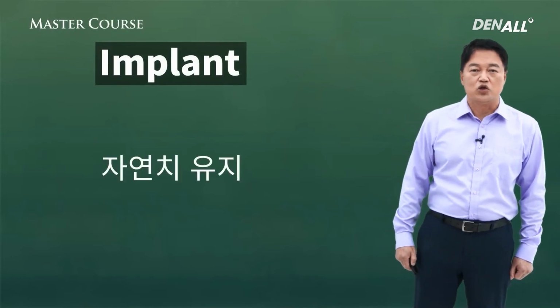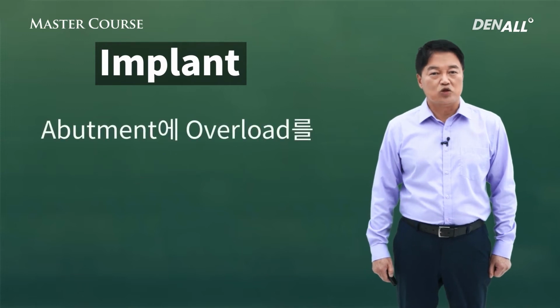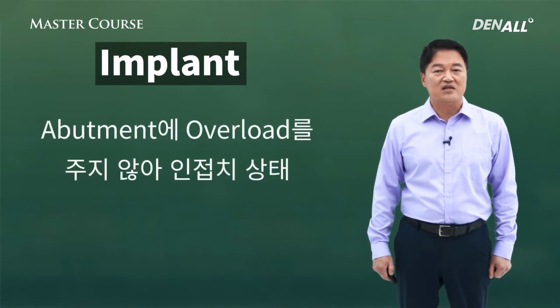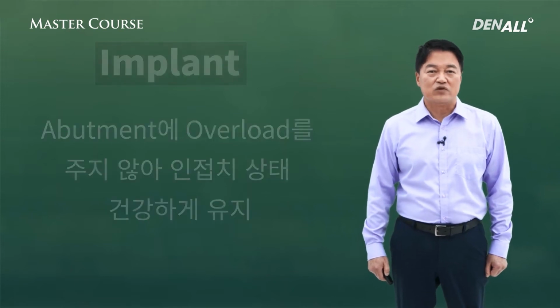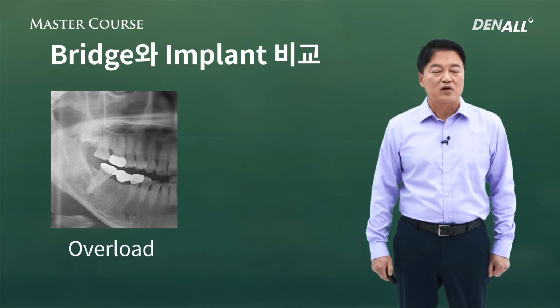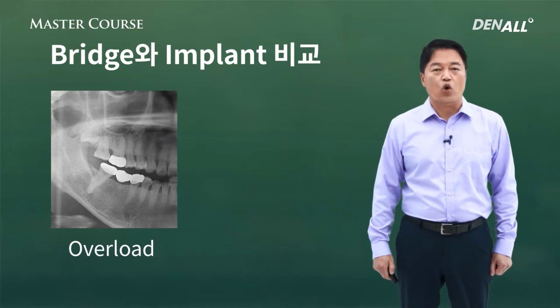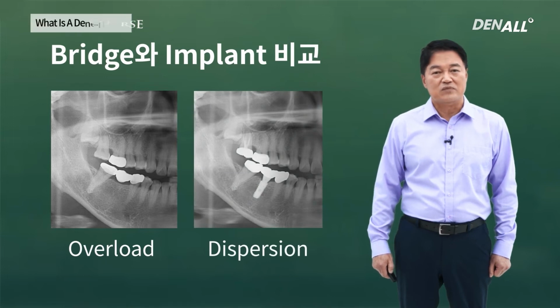On the other hand, natural teeth can be maintained if you use an implant, and overload is not applied to the abutment, so adjacent teeth can be maintained in a healthy way. Let's compare bridge and implant. With a bridge, in the missing area, overload is applied to the abutments on both sides. However, if you use implant treatment, force is dispersed.